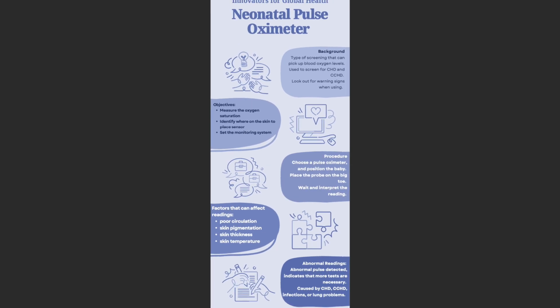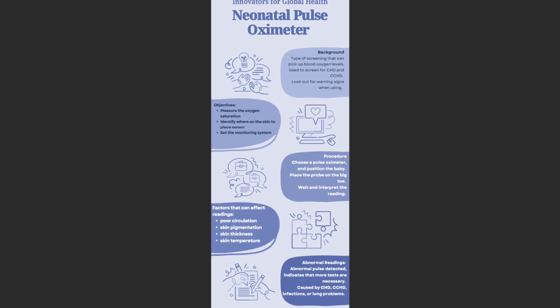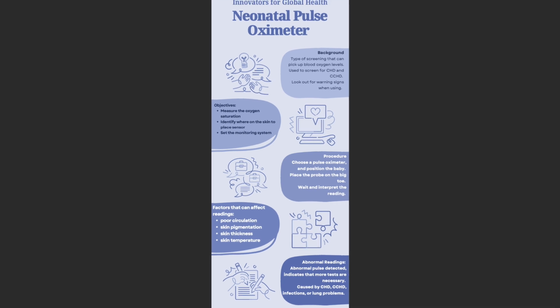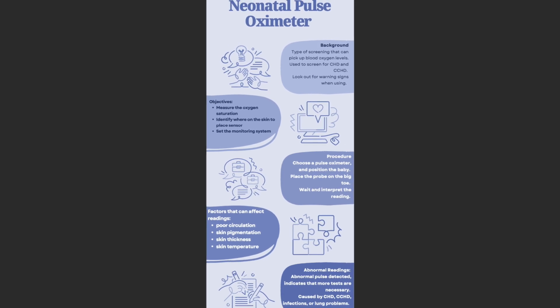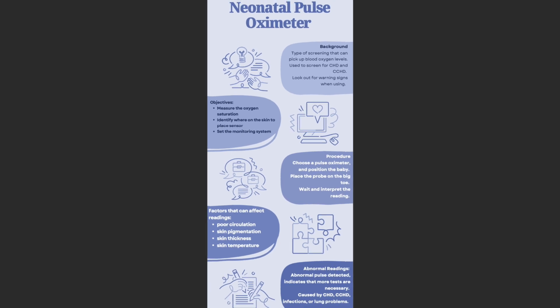While the machine can detect an abnormal pulse, this does not necessarily mean that the baby has a heart defect, meaning that there can be false positives. In cases where the baby has lowered oxygenated blood levels, this may be attributed to infections or even lung problems.